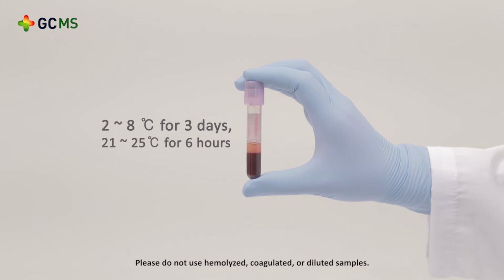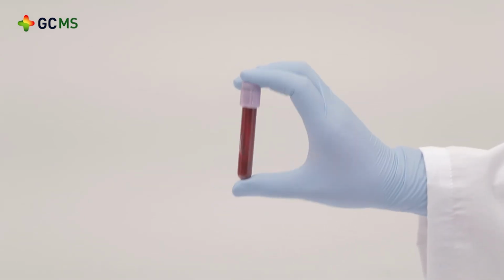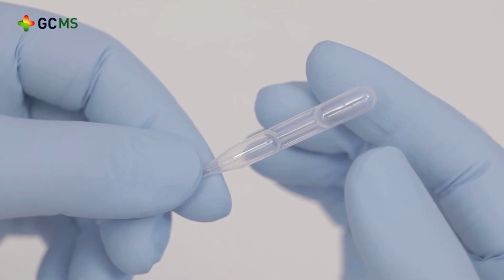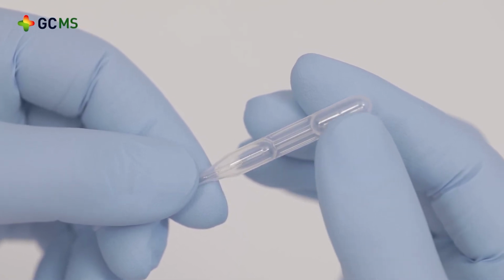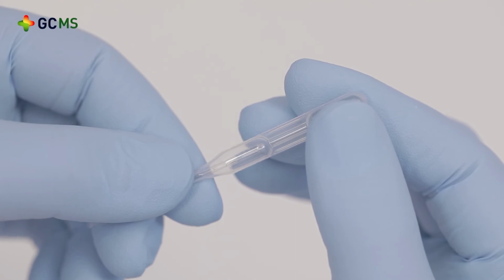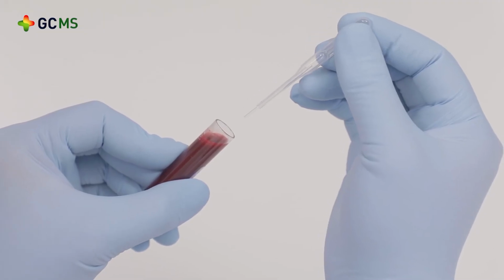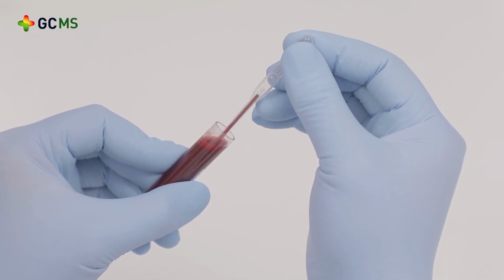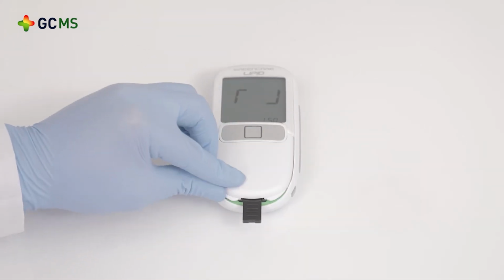Please do not use hemolyzed, coagulated, or diluted samples. Gently mix the sample by inverting the tube 8 to 10 times before using. Slightly tilt the tube. To collect a venous sample, place the capillary tube onto the venous sample while pressing the top of the tube. When you have completely taken the venous sample, gently press the tube to put the sample into the strip hole while closing the air hole on the capillary tube with your finger. Complete the test as described for the capillary tube sample.